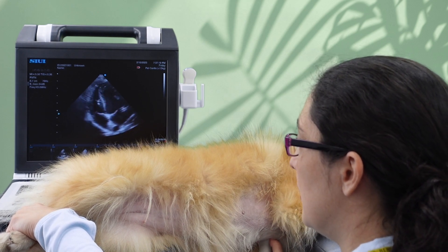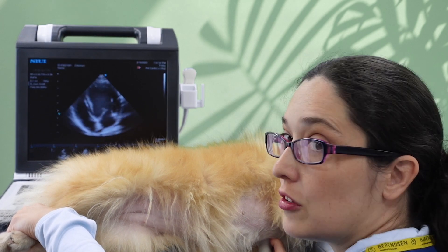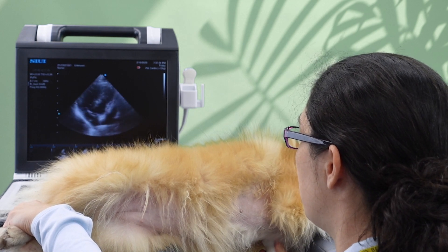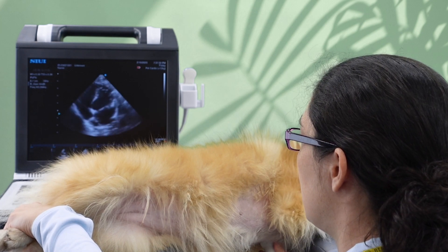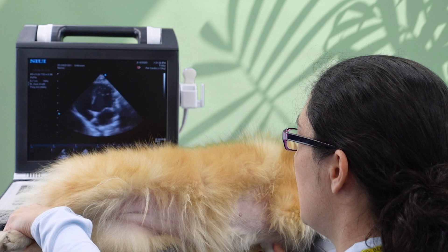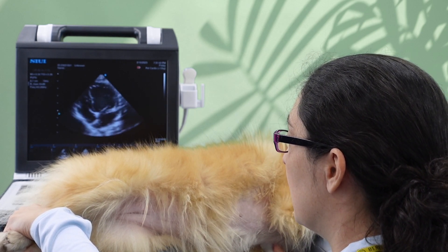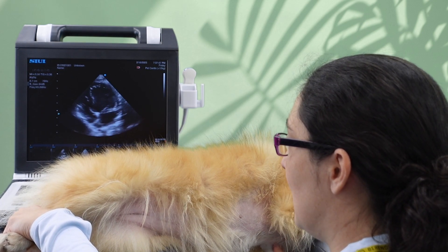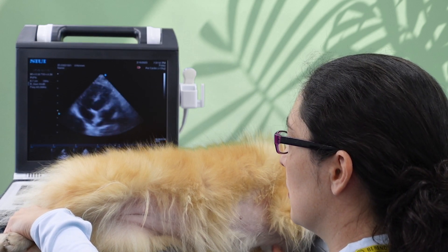As well as an off-axis image, the other mistake is to foreshorten the ventricle. You want the ventricle to be as long as possible. If you go too high a rib space, do you notice how the ventricle looks very small? It's almost the same size as the left atrium and it's coming in on itself. In reality, the apex should not really be moving — it's the base of the heart that moves down towards the apex in systole, not the other way around. So this is one sign that you have foreshortened the ventricle.